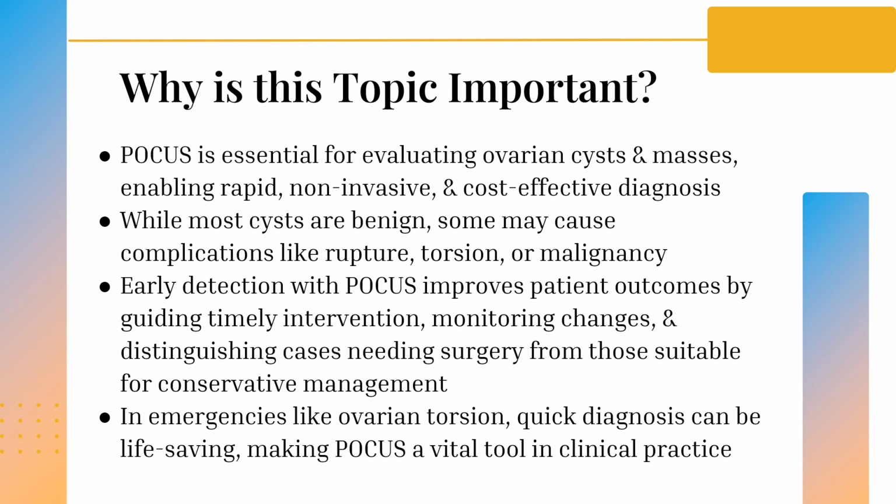So especially in urgent care, triage setups, and in a clinic in a rural setting, having point-of-care ultrasound for gynecological concerns, particularly pelvic pain and ruling out ovarian cysts and torsions, is really important.